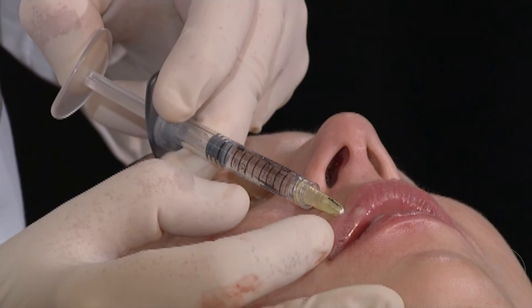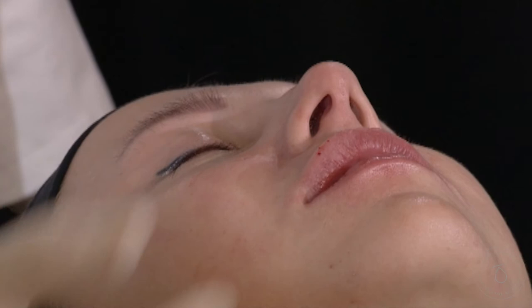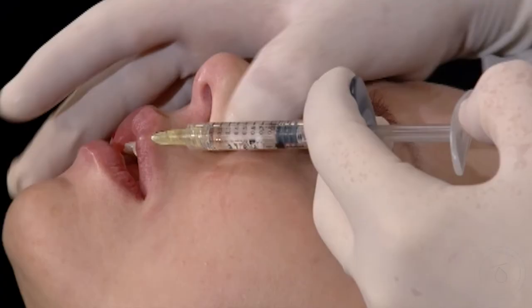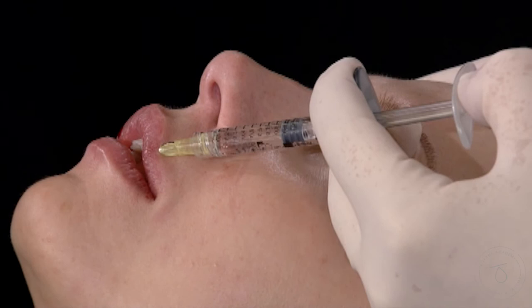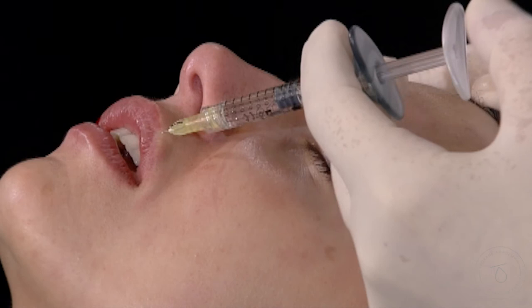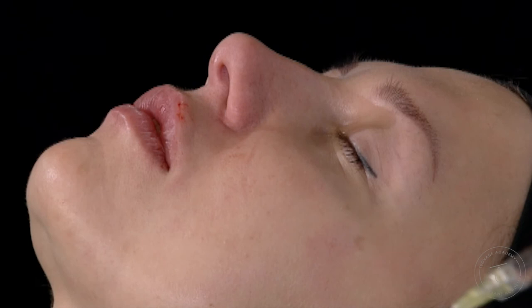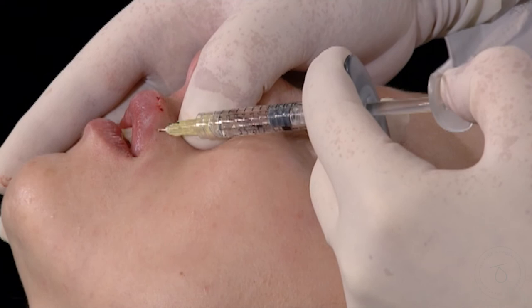Same thing — I reverse, tangent, boom. You see? It flows. Simple, very gentle. Reverse, tangent, four millimeters. Because if you go a bit lower, let's say six millimeters, the filler will come here and will make funny lumps. So you have to be very precise. Massage, placement, sculpting — essential.